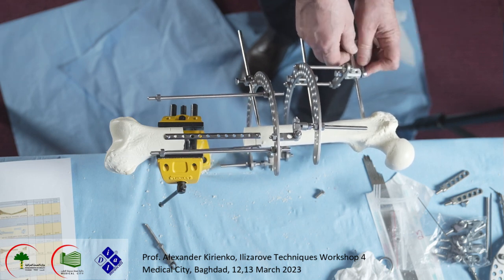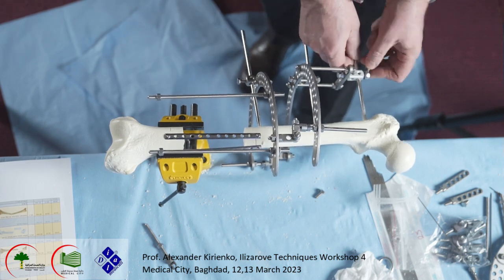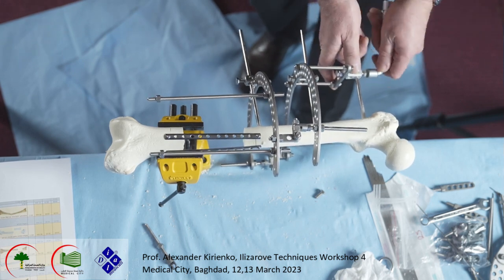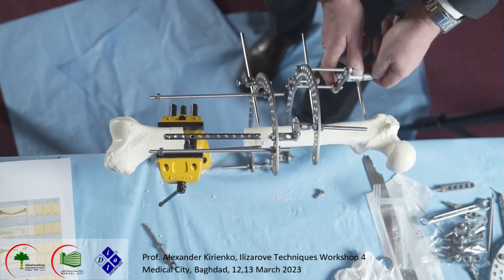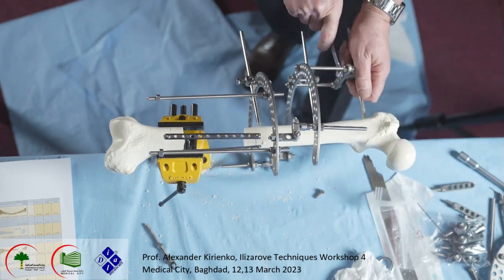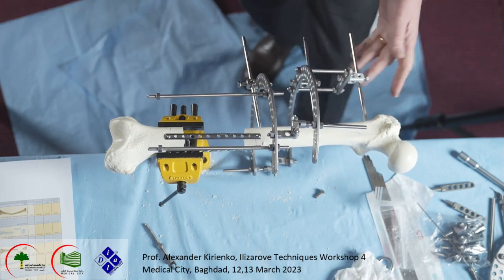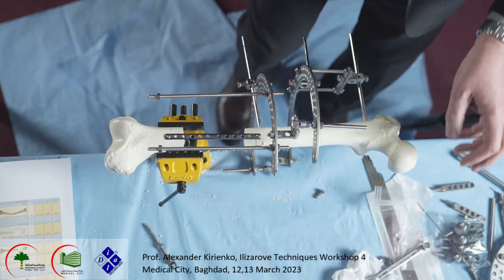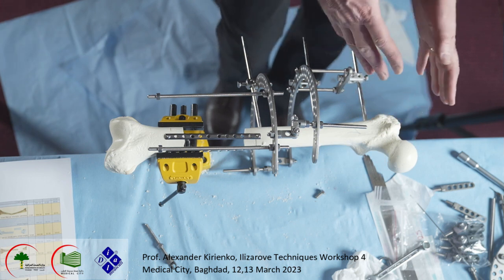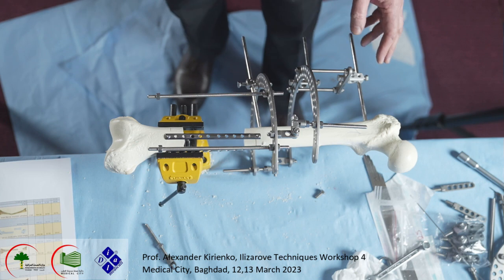Right angle, do you have? Right angle. So give me, please. It's easy, a little bit easy. Okay, you see it's much more stable now. This system is comfortable for the patient because the gluteus muscles will be free. He may sit. If not, the ASIS will be too high. Okay, now we stabilize it.